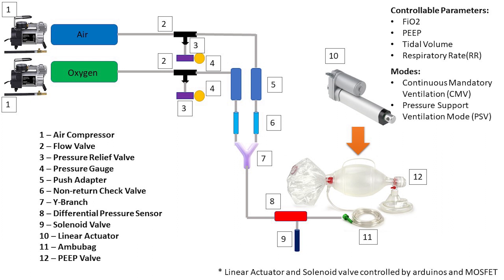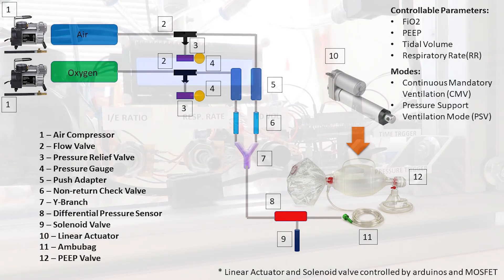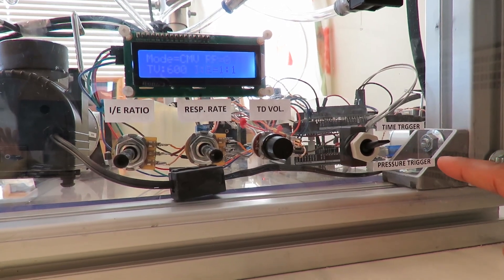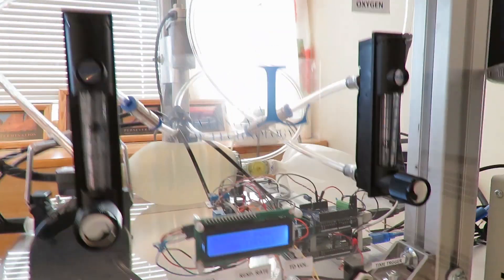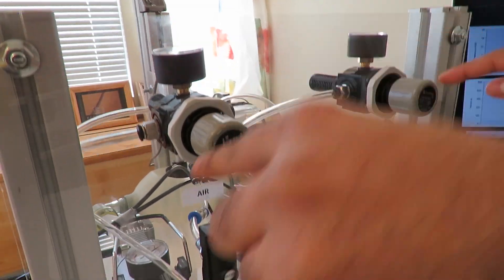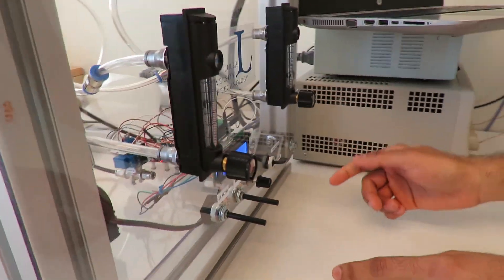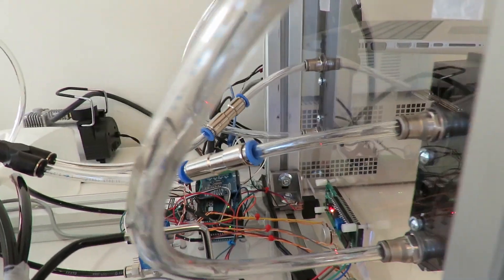In addition, following guidelines from the UK Medicines and Healthcare Products Regulatory Agency, we have included two operation modes that a ventilator from standard manufacturers normally has. The two modes are volume control continuous mandatory ventilation and pressure support ventilation. The pressure-regulated air and oxygen supplies, once controlled with the flow valves depending on the FiO2 required by the patient, go through the non-return check valves and mix at the Y branch.